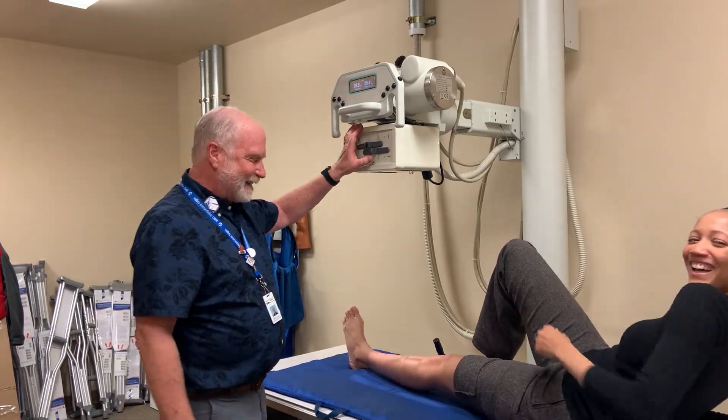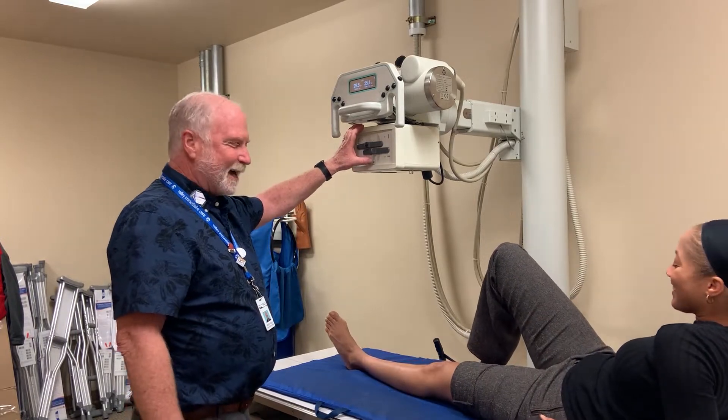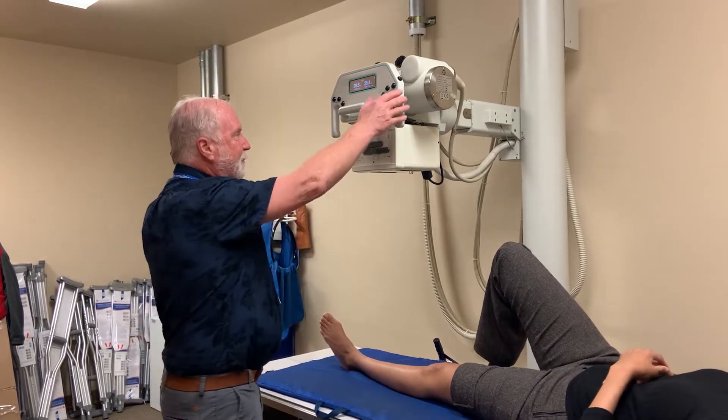Okay, let's talk about knees. So I'm going to have Nikki lay back on her back. Knees generally from an AP.